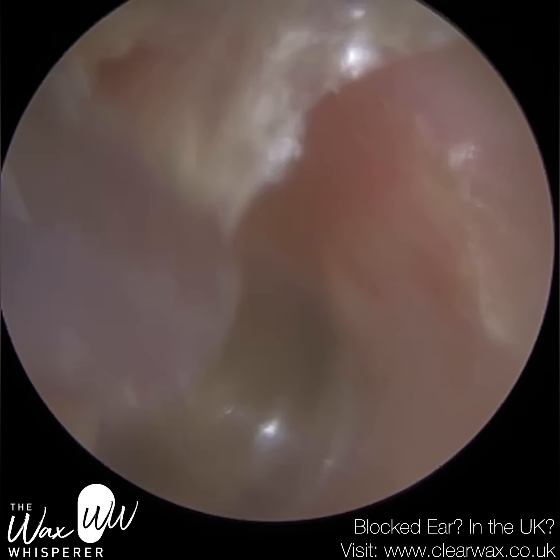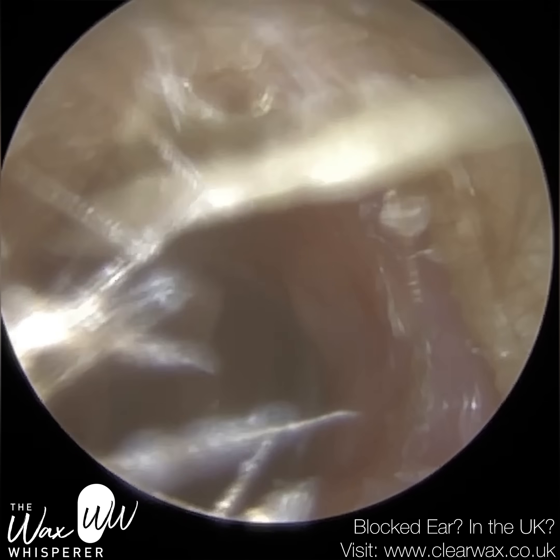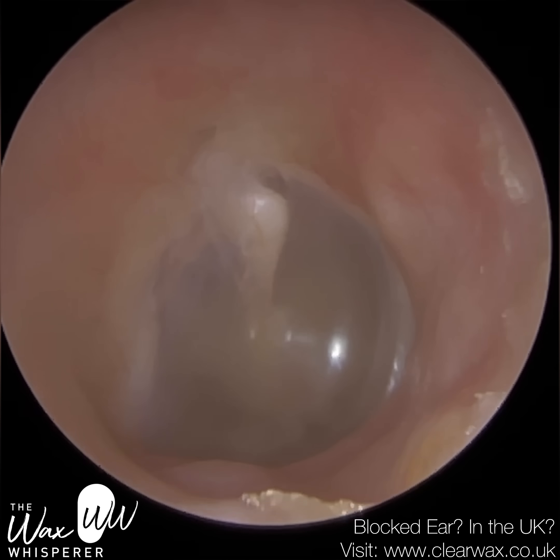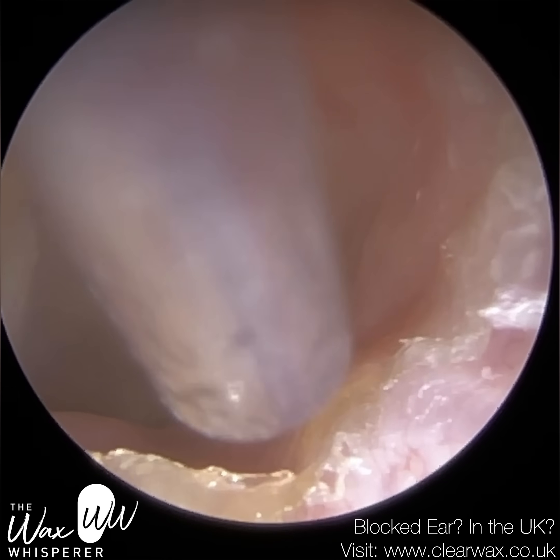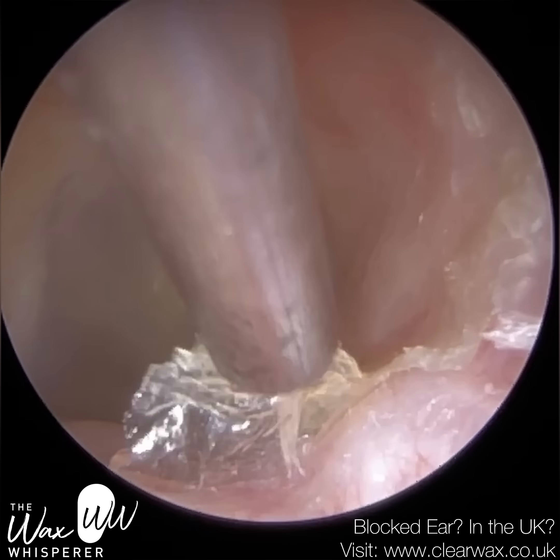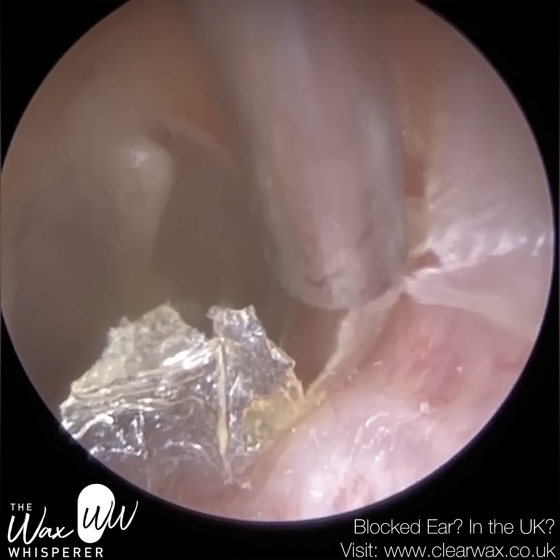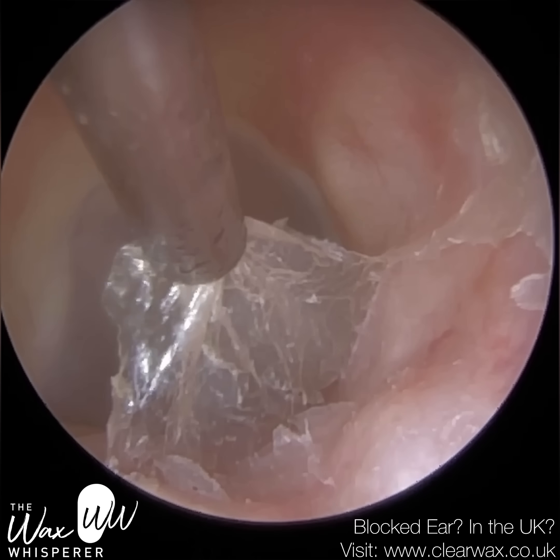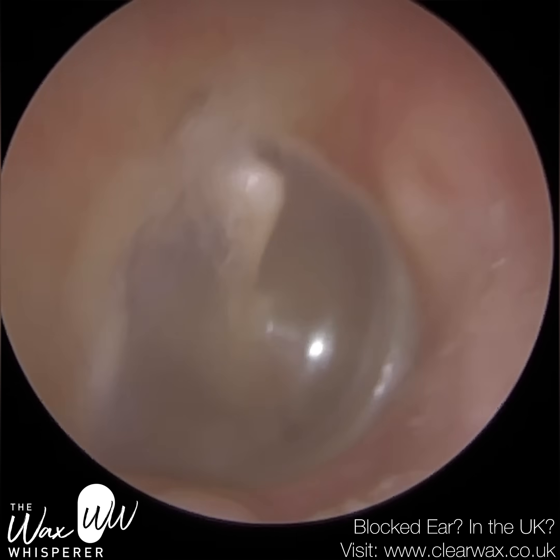Sometimes it can be triggered by patients poking inside their ears, causing trauma and microabrasion, because that part of the ear canal can become inflamed — and inflammation can cause a higher than normal turnover of dead skin, which can lead to a plug forming. You can see this canal is very bumpy; the terrain here is quite hilly, which can also make it more difficult for dead skin to migrate. I don't know whether this hilly terrain is a result of the patient having keratosis obturans, or whether this is anatomically normal for this patient and has led to the condition — it's almost like a chicken and egg scenario. In both ears there is some expansion of the bony canal wall, so I would say this is a grade one.